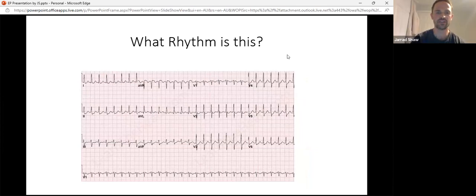So you've got to use your ECG. Is it AF? Then that is what you treat. Is it atrial flutter on the ECG? Then that is your primary target if that's what they're presenting with, and that's what you treat. But for these narrow complex tachycardias in the right patient with the right history, your focus will be going down that SVT route. And as I said before, even after the ablation, we spent a lot of time doing pacing maneuvers.